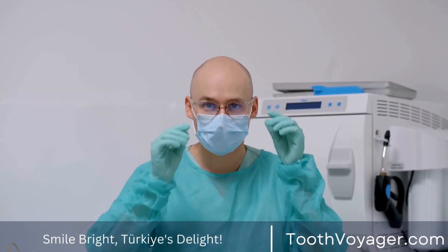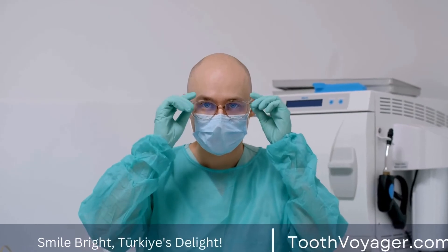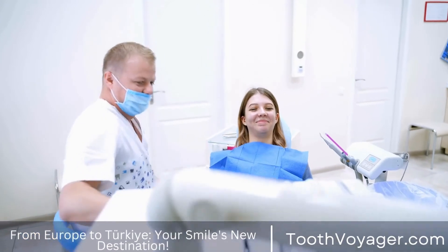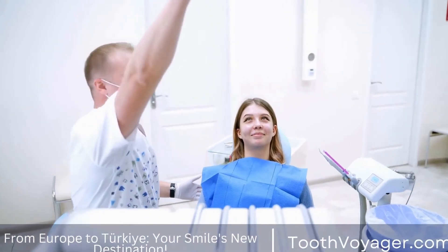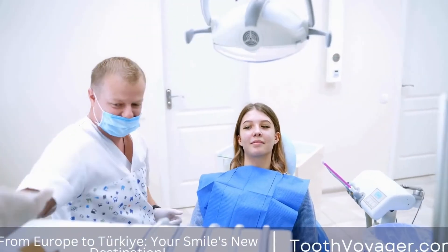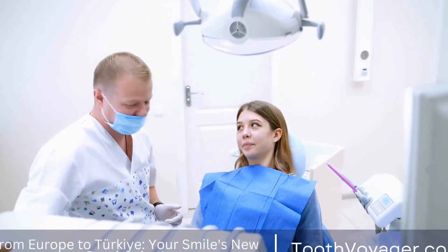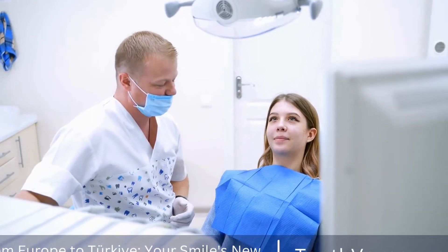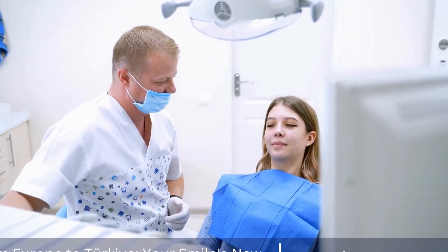Step 5: Placing a Crown. In some cases, a tooth that has undergone root canal treatment may require a dental crown to strengthen and protect it from further damage.